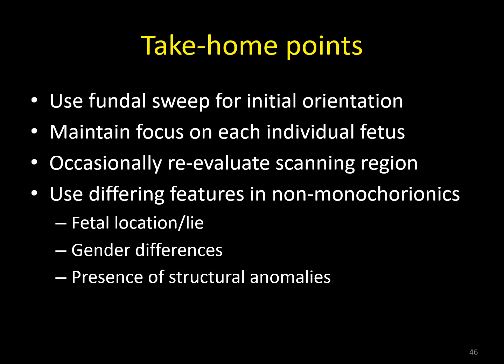So in summary, these are the key take-home points that you should remember. Use the fundal sweep for initial orientation of the fetuses, the number and lie of each fetus. Maintain your focus on each individual fetus and stay with that fetus until the exam for that fetus is completed, and then move to the next. You want to re-evaluate your scanning region occasionally, which just means panning out or zooming out and ensuring that you are scanning the fetus that you have intended to scan.